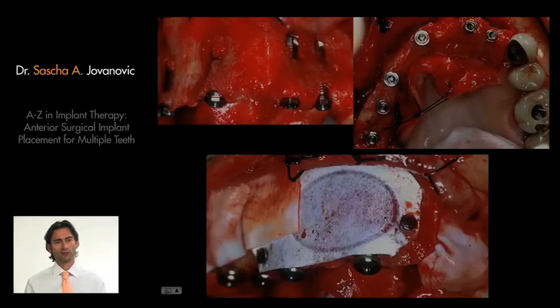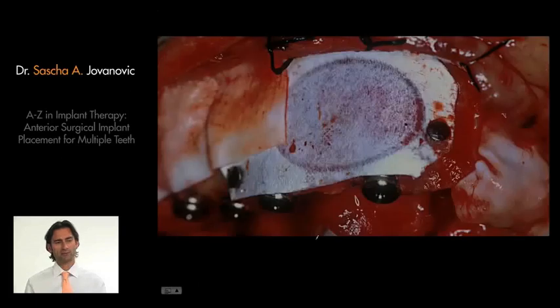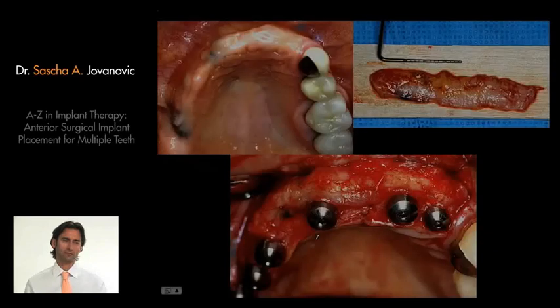A total of 6 implants, a total of 1 sinus graft, 3 implants with bone grafts. So this is quite an extensive treatment, all done simultaneously, but a maximum benefit for the patient because we place implants, sinus, and ridge augmentation all at the same time. The patient now can go through healing. You can see here how this particular area will heal uneventfully for the next 6 months.